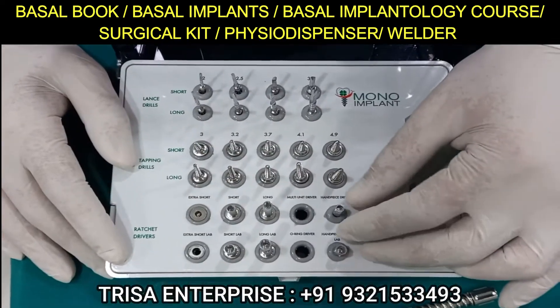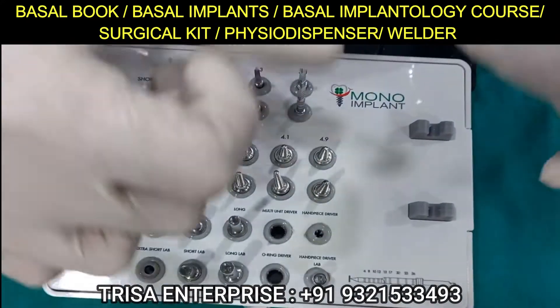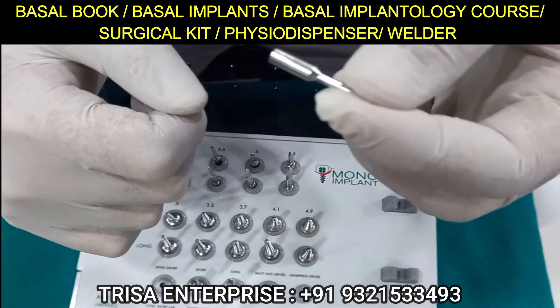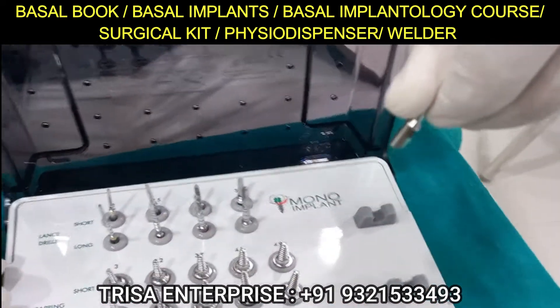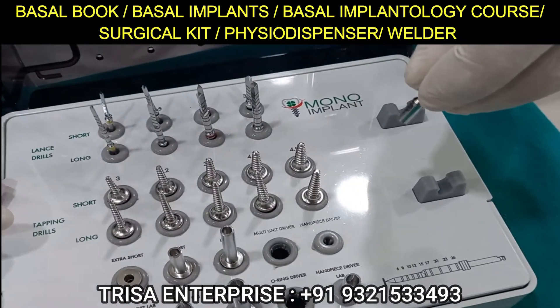This is called a lab hand driver, but it is more for the compressive implant. Some doctors prefer not to touch the implant directly — they can pick it up with this, attach it to the motor, keep the motor at 50 RPM, and slowly introduce the compressive implant into the bone, just as you would for a conventional implant.